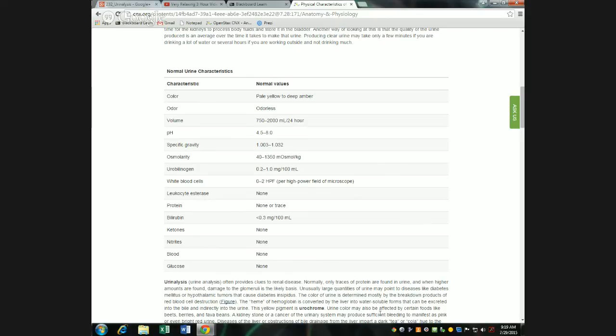So let me explain how this is going to work. I'm going to be using my green tea sample here as an example. Remember, this is not actually urine. You'll need a conical tube, of which there are a bunch. Not all of them have a scale printed on them, but you need to put 12 milliliters of sample in your tube. I'm going to leave my sample tube up here, which again does not actually have urine in it, it's green tea.